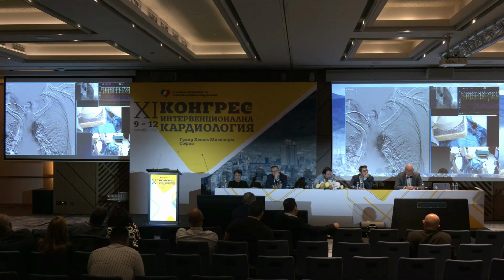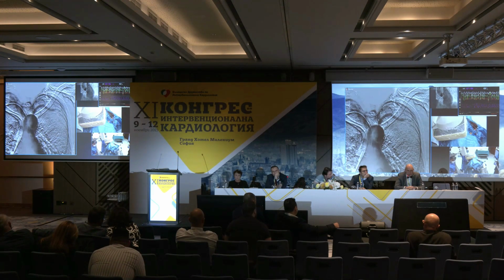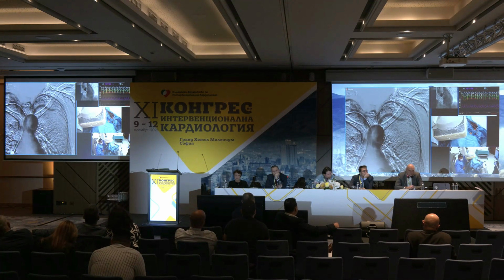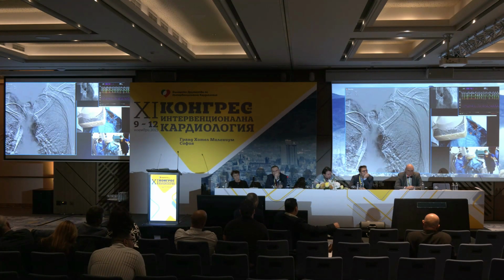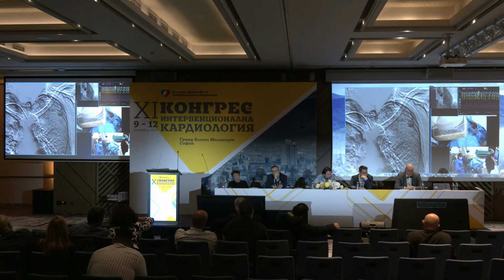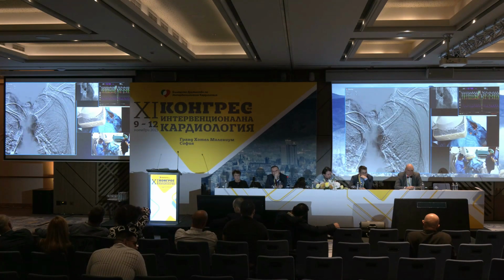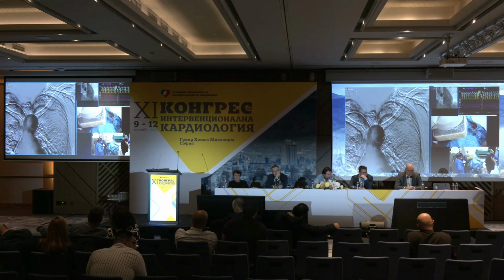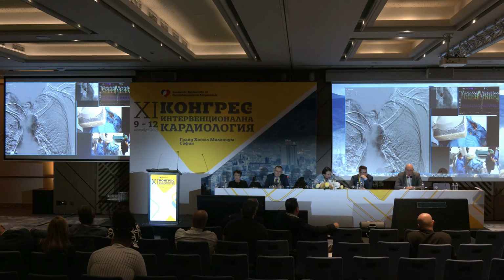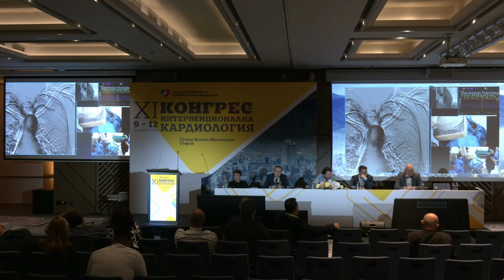So that was the second question. How effective is the compression in this area to block the leakage? It's very efficient, because it's over the chest. So we have very good basic tissues, firm basic tissue, and it's absolutely efficient. Okay, and how long do you wait before you implant a permanent pacer? At least 24 hours.